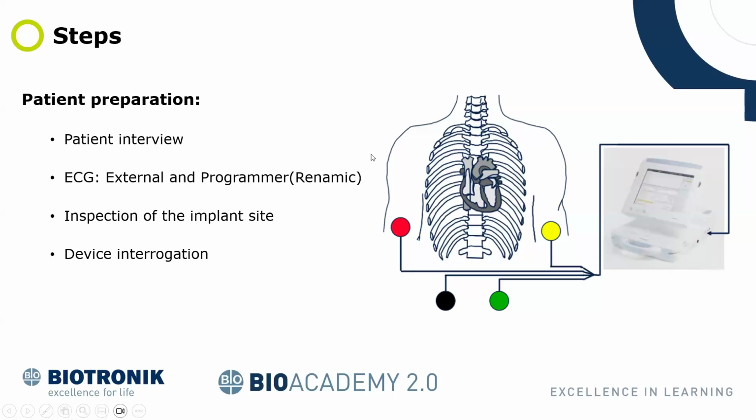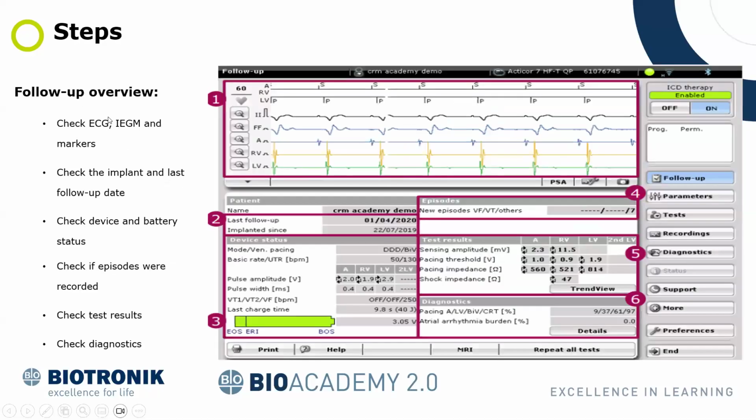All right. Thank you. So you need to connect the ECG, that is external ECG, and programmer ECG, do inspection of the implantation site, and device interrogation. Next is the follow-up overview.